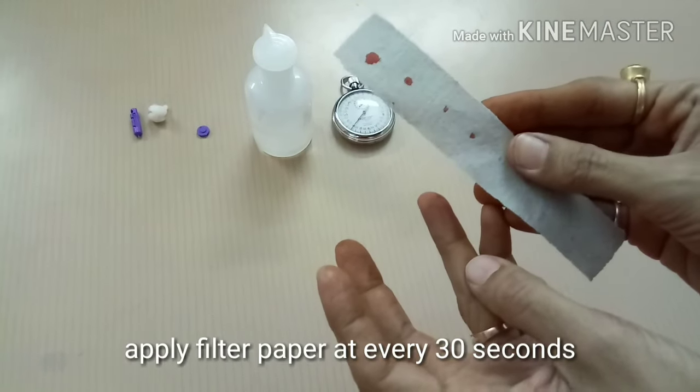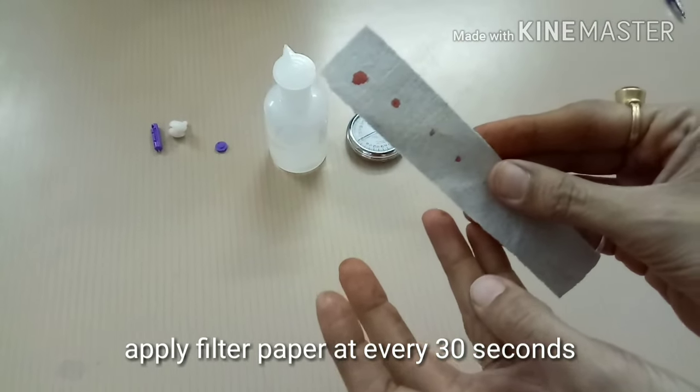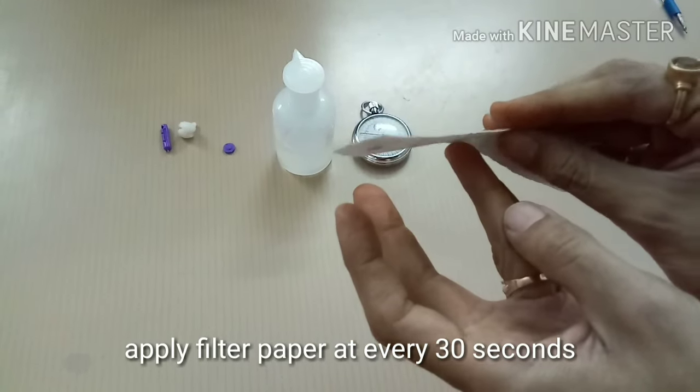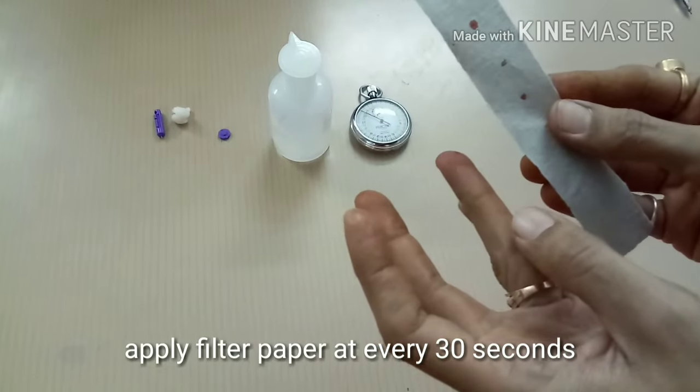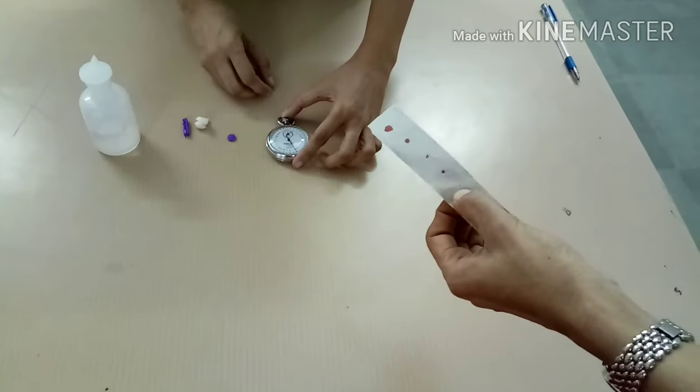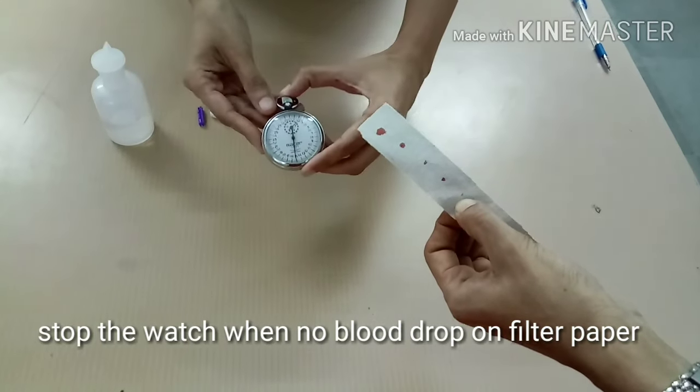Apply the filter paper on pricking side at every 30 seconds in a sequence. Stop the stopwatch as soon as bleeding stops.